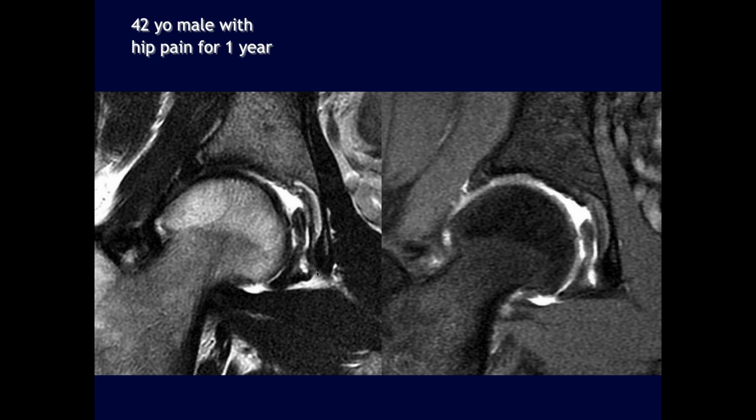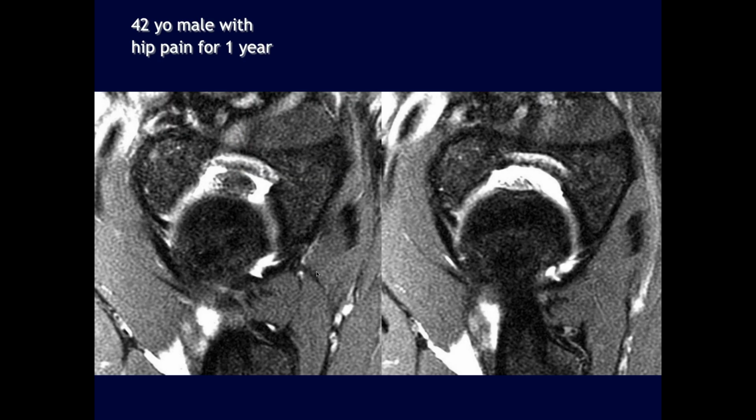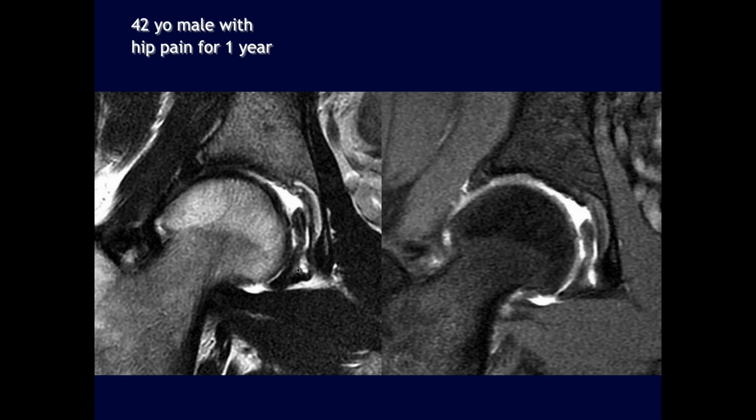We have a 42-year-old male with hip pain for 1 year. There's some increased signal in the region of the ligamentum teres. Not sure if this could represent strain. Here it looks like it's actually a complete tear. It looks like it's torn. Oh, okay. That's hard to tell there.